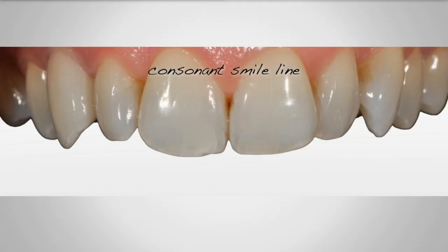A question was asked, it's a good one. If you're an implant surgeon, what does your implant surgeon do if you want the screw axis hole too far buccally for the bone? I mean, then you have to make concessions. You might have to angle the implant. In that case, you probably can't use a screw-retained provisional, and you would have to use cement-retained. I use this process whenever I can, but if ideal alignment is going to cause a dehiscence or a fenestration, then we have to adjust a little. Good question. All right, so back to the smile line.